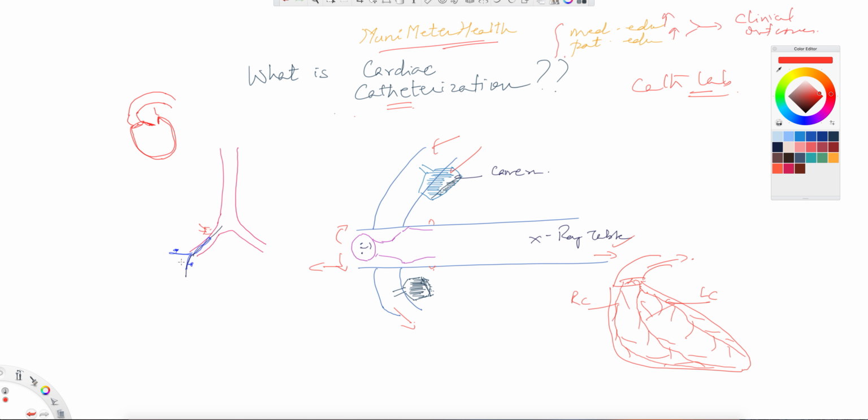Once the needle is withdrawn, a sheath, it's called a sheath, is inserted, with a small aperture created through the skin, sometimes with local anesthesia, and that sheath is advanced up onto the guide wire. Then the guide wire can stay in or be removed, but normally it is removed once you have the sheath in, and now it's in the vessel.